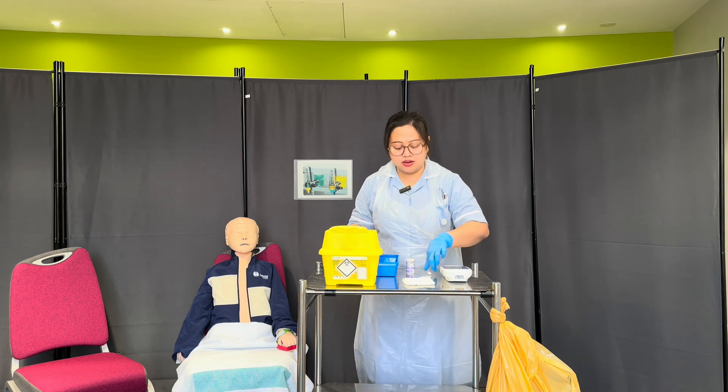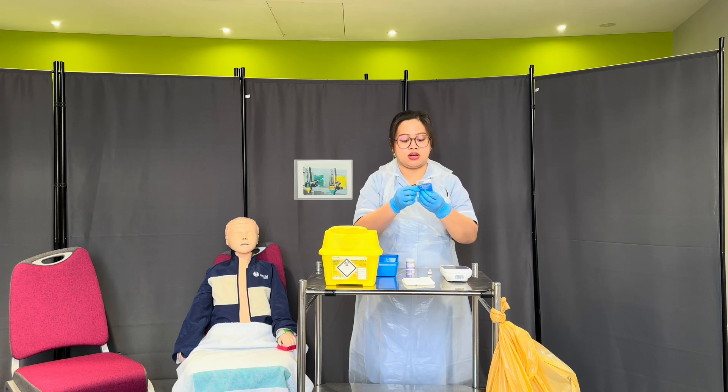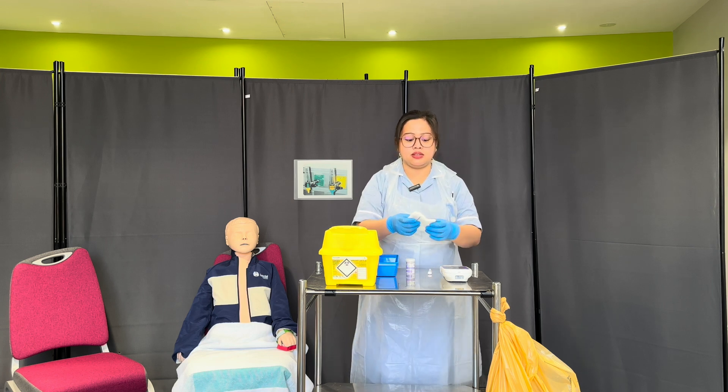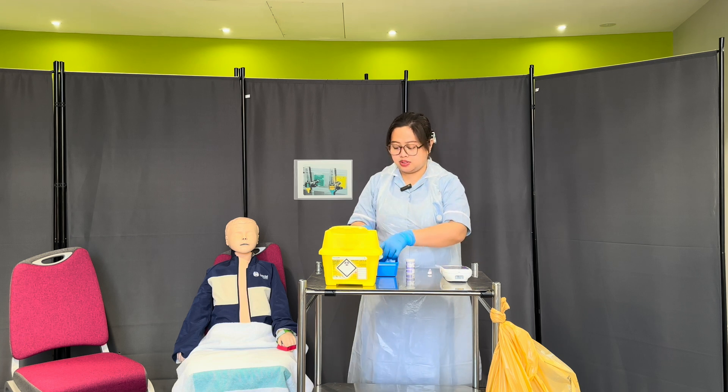I have here my clean wipes. The package is clean and dry. Expiration date is 2024, so I'll be happy to use this. I have here my clean gauze — it's clean, never used, and dry, so I'll be happy to use this as well.